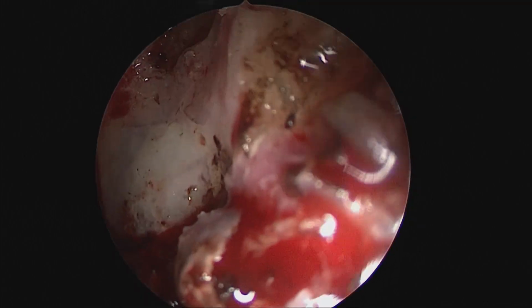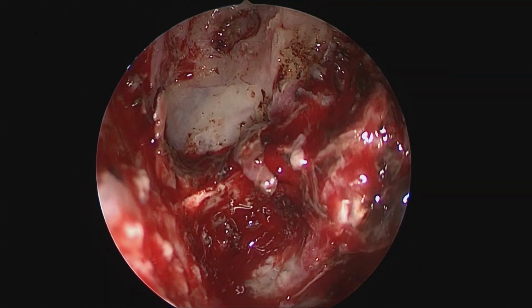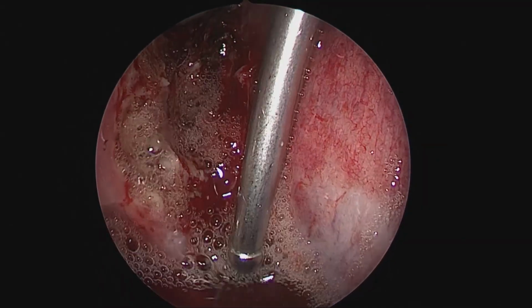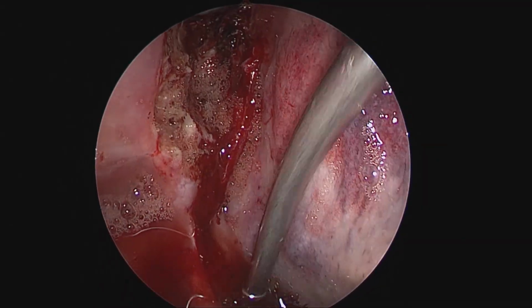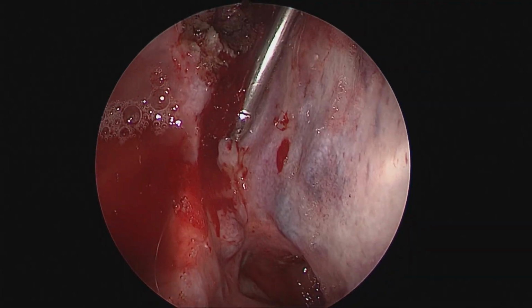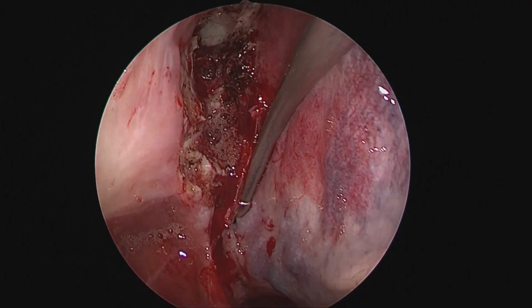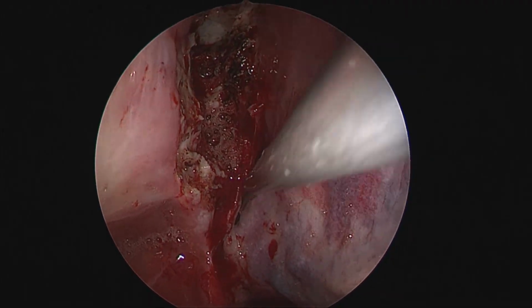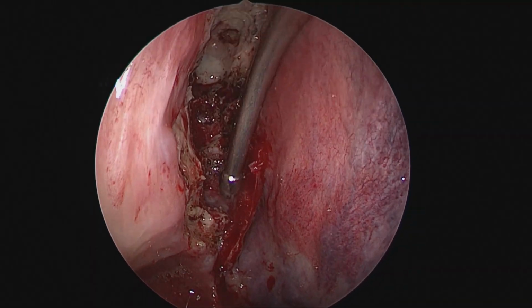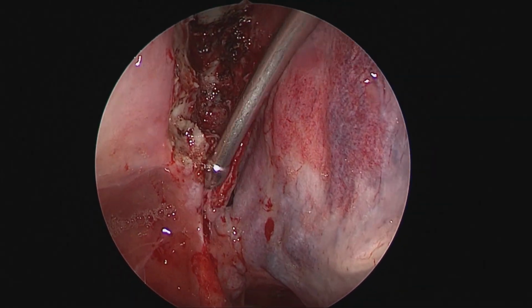So you see here, most of our procedure is done, and a lot of bare bone is exposed. Most of it, which was considered disease, has been ablated clearly, and this is an upward looking view with a 70-degree endoscope camera onto the skull base. We are seeing the floor of the orbit, the septum, the roof, the sphenoid sinus medial to this middle turbinate, and that completes the surgery.